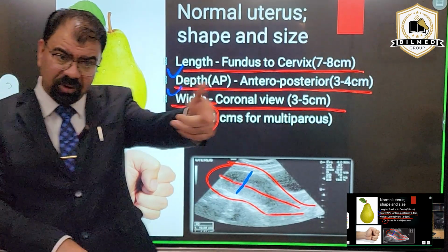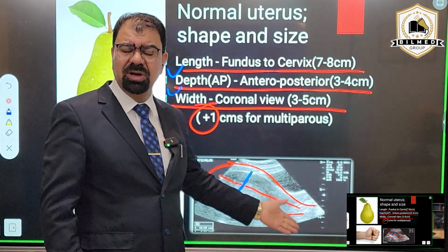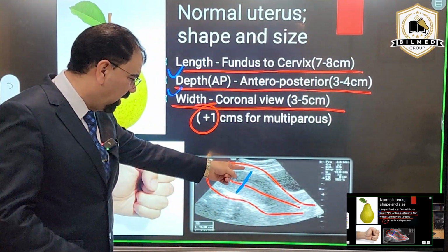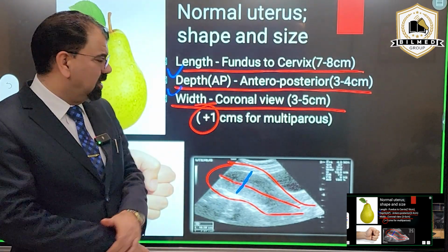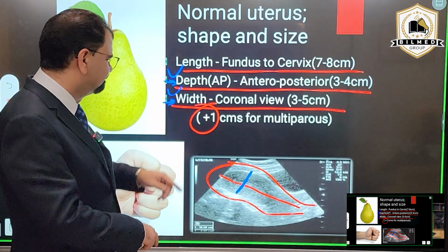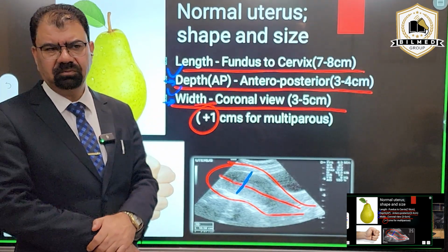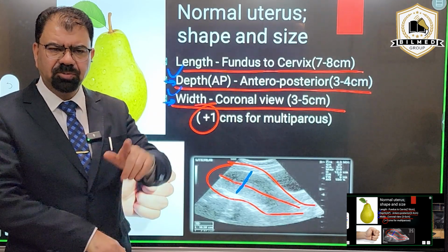Others, post in the comment box. You see this type of uterus in longitudinal section each and every day. If I am measuring this blue line over here, is this depth or is this width?